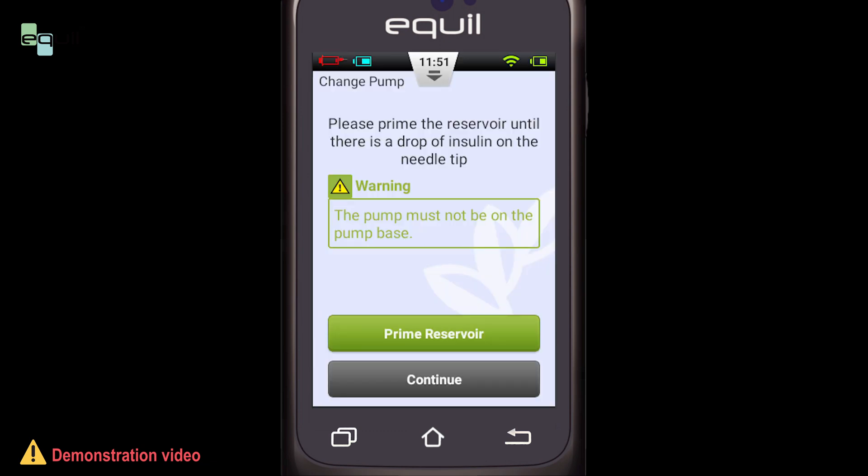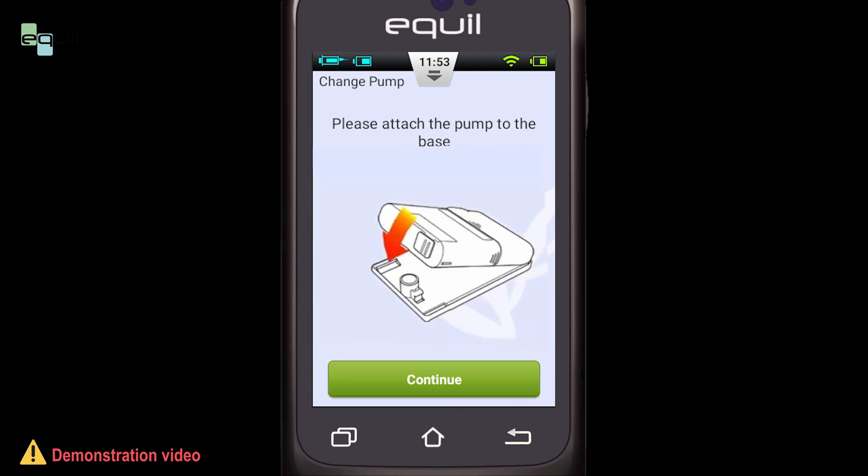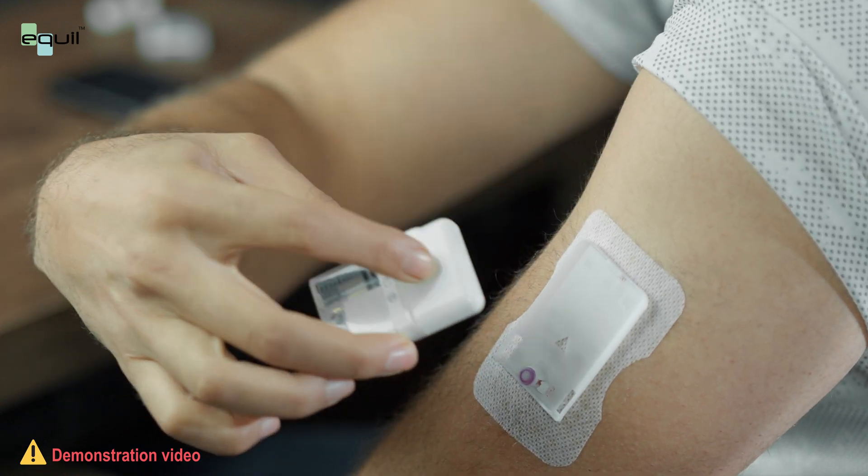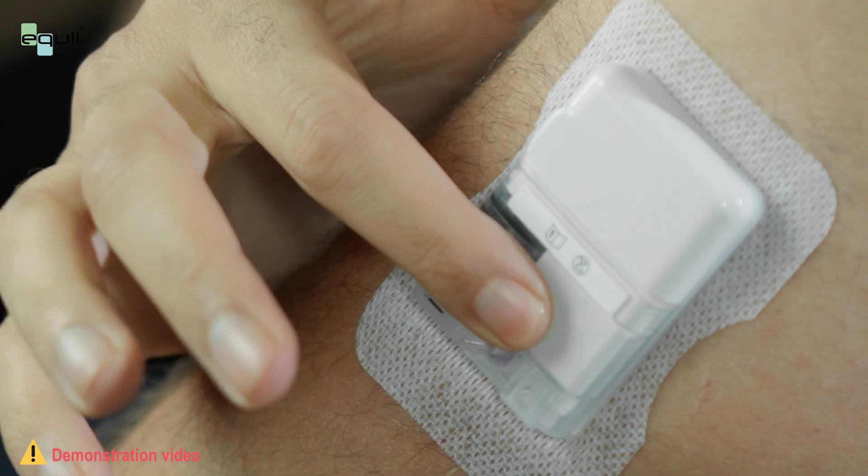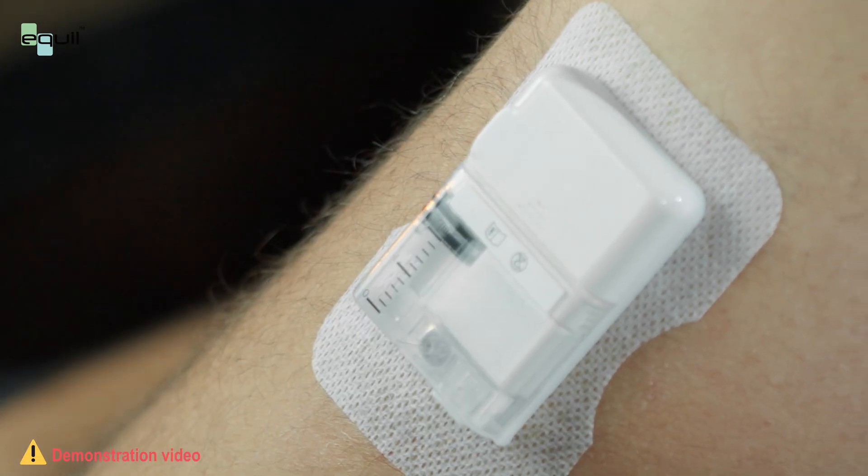Here, Continue button will turn from gray to green. Select Continue. Now attach the pump to the pump base. Fix it in the right orientation and push it from backside until you hear a tick.